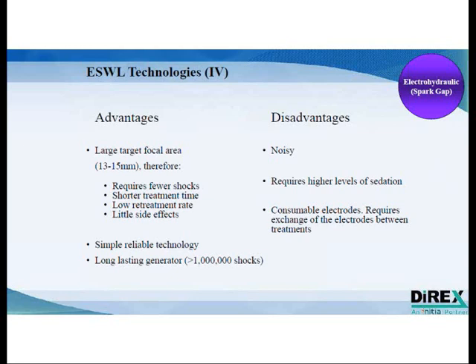It is considered a painful treatment, and in most countries the patients are put to sleep. One of the disadvantages is that there are consumable electrodes, which means that you have to replace the electrodes every few patients.